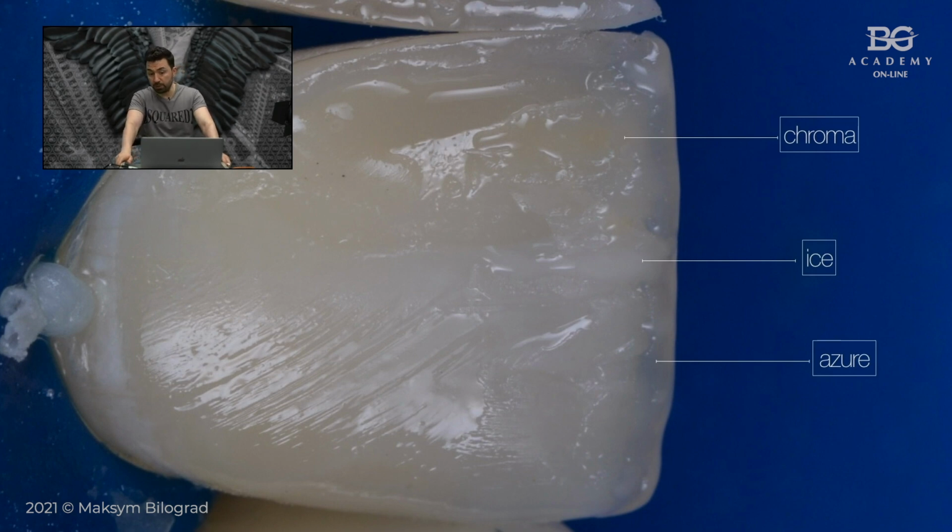From my opinion, this is one of the best. These are one of the best tints in the market for composites. These tints are from Inspiro. This is the name of the composite, Inspiro, created by my mentor Didier Dici. The perfect chromacity of the tints, the perfect opacity of the tints. They are highly flowable composites, by the way.